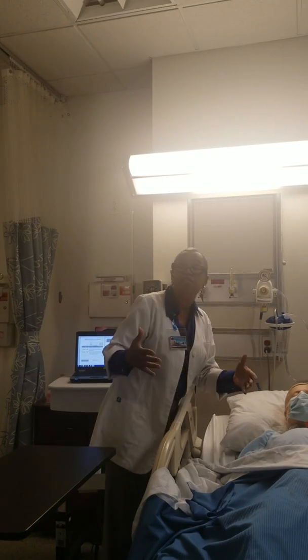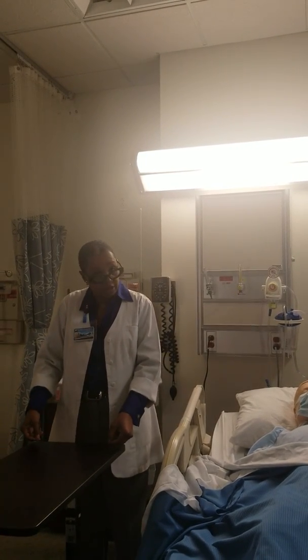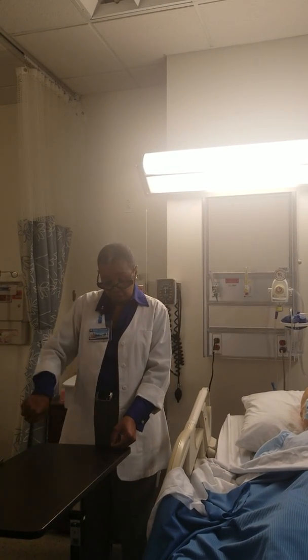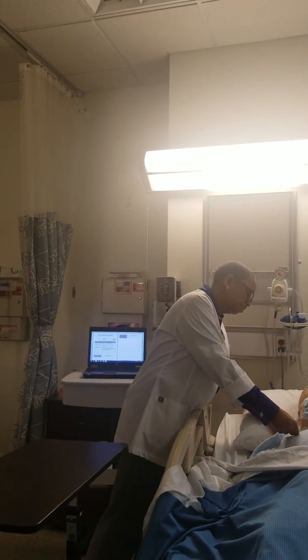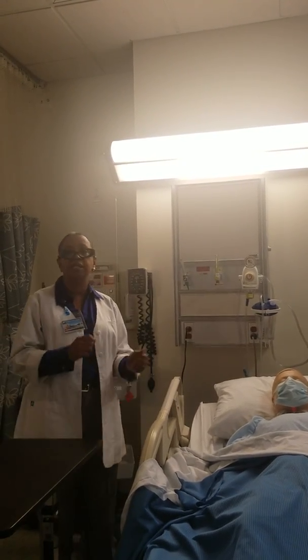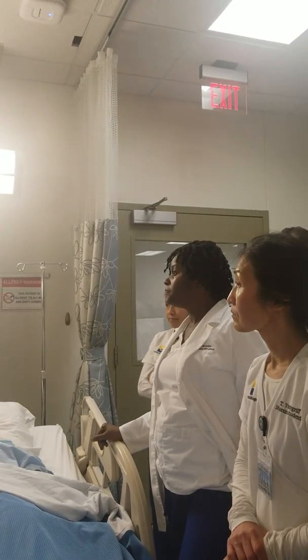You get what I'm saying? You stay away from the actual line. You get it on the edges. And like I said, you can use the other hand to pull it off, but you have to hold it on the edges. When you hold it on the edges, like this, you can easily move it here, never touch that site and put it down. You're going to need 2 hands, absolutely. I use 2 hands to put it on. You can't take it down with one hand. People will try it, and then it balls up on you.